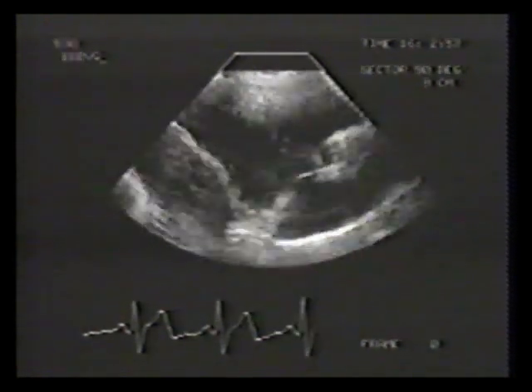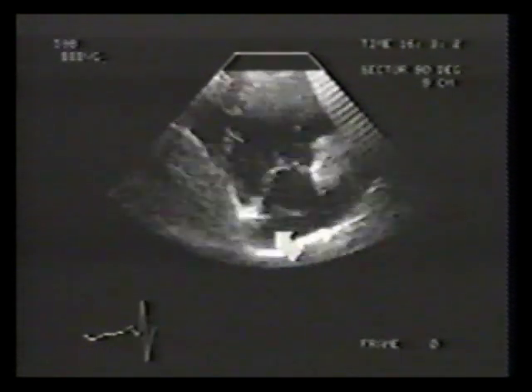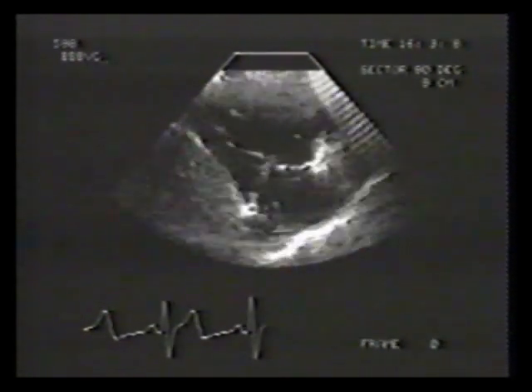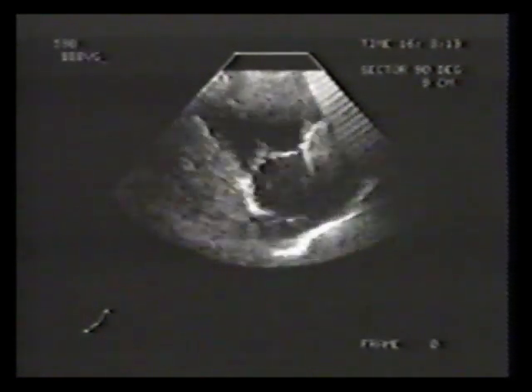In this long-axis scan into the right ventricular inflow, notice that the eustachian valve is attached at the orifice of the inferior vena cava, has an undulating motion in the right atrial cavity, and should be diagnostic of a large redundant eustachian valve.